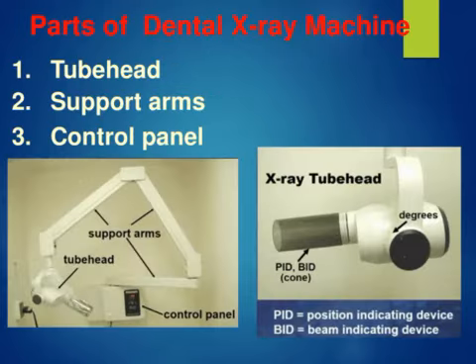Okay, so which is the property of X-rays which we can use in extraoral imaging?